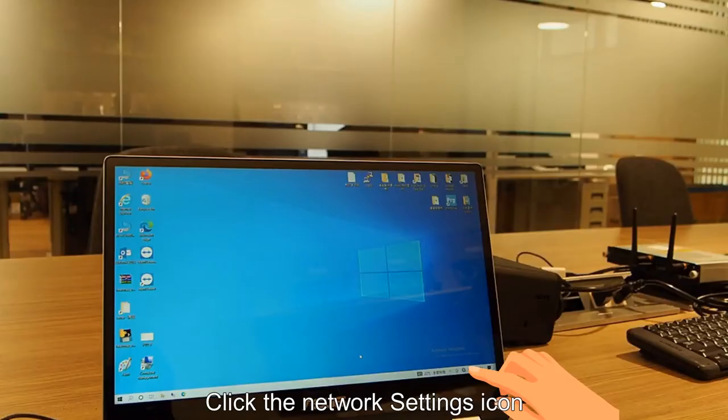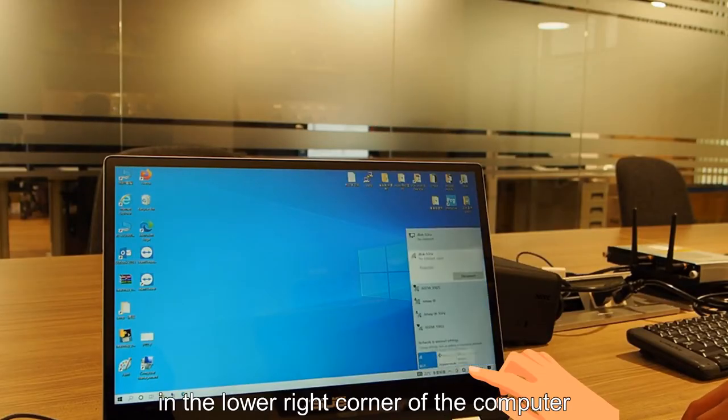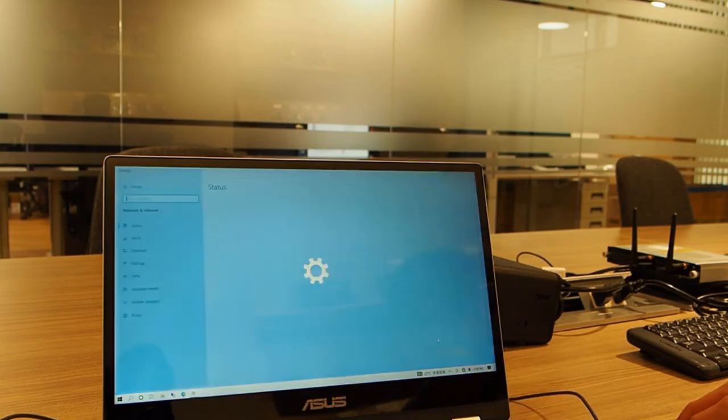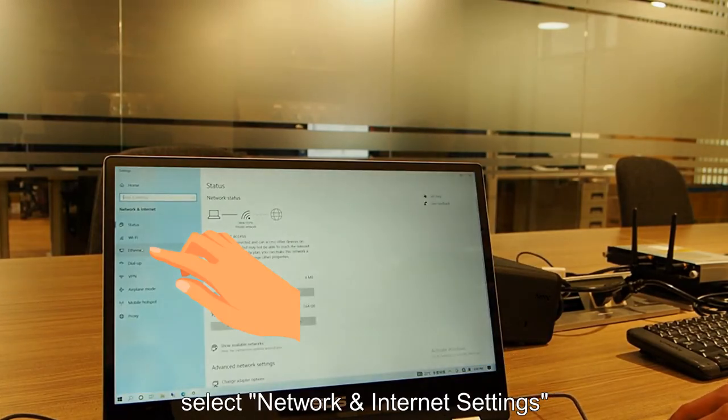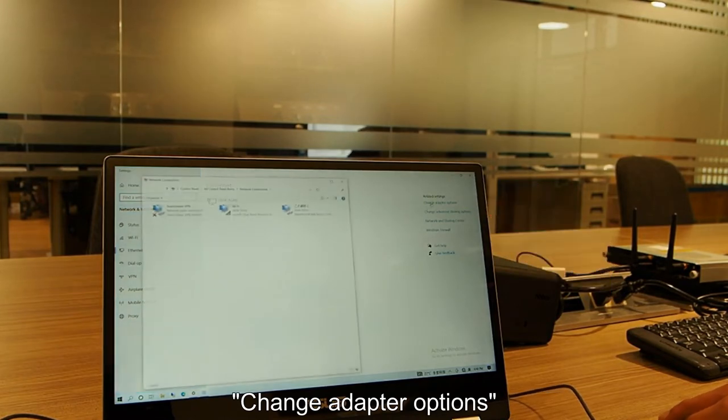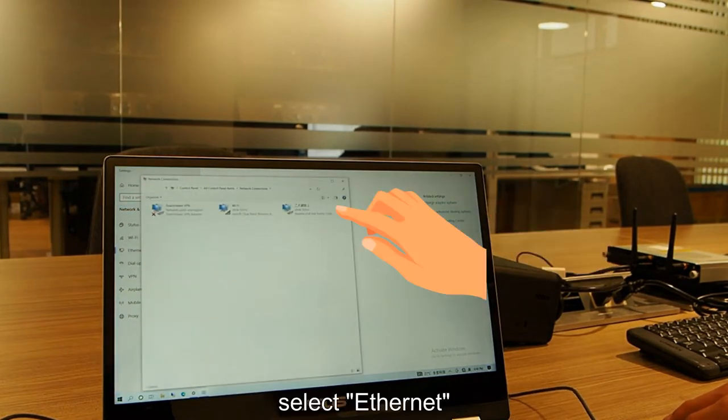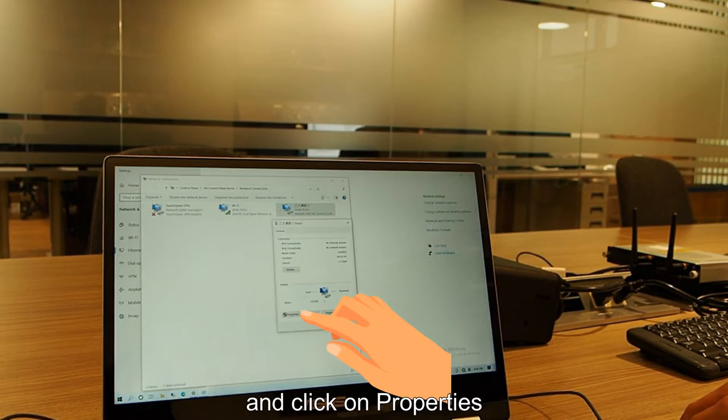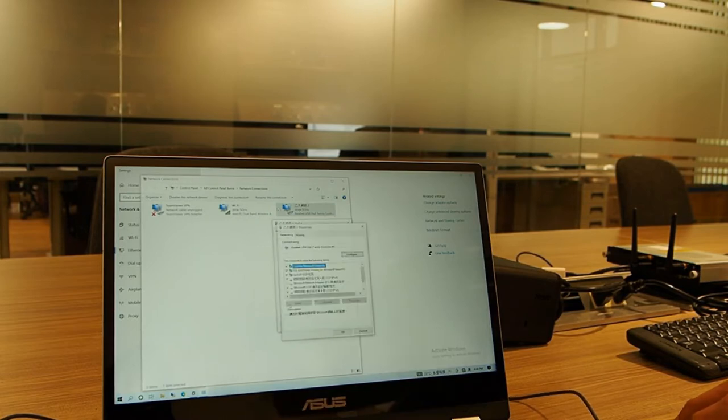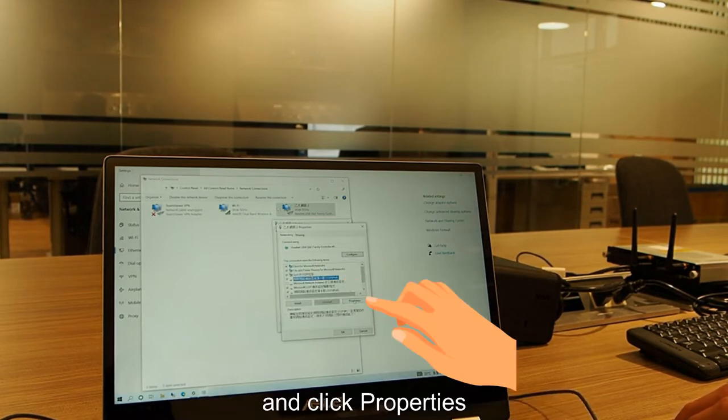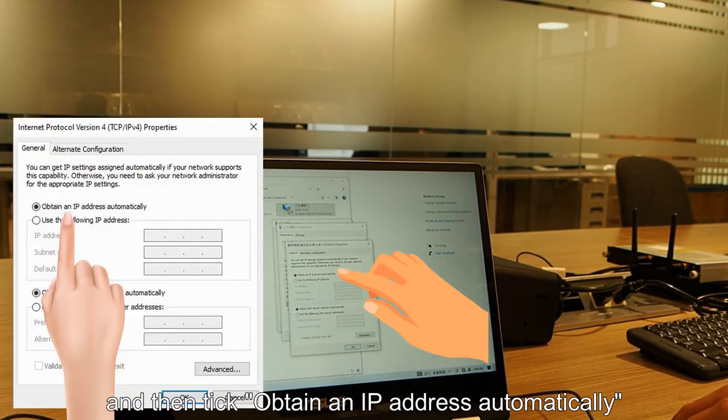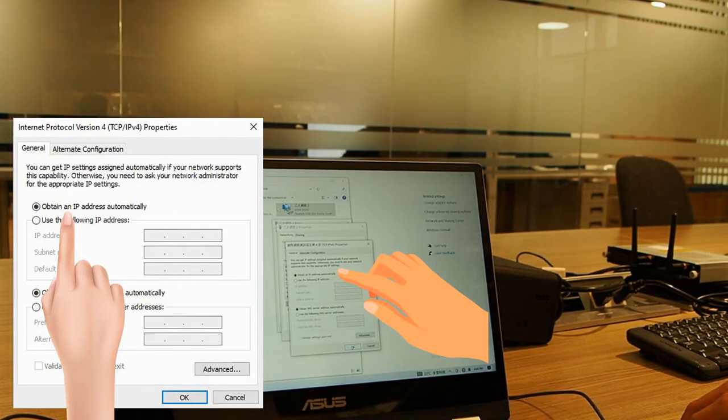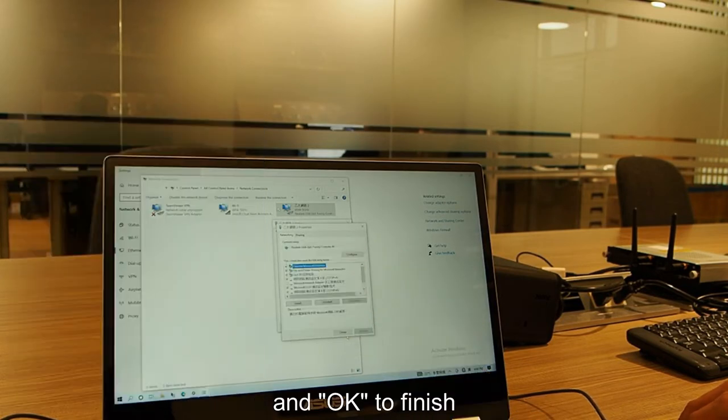Click the network settings icon in the lower right corner of the computer. Select network and internet settings, then change adapter options. Select internet and click on properties, then click on properties again. Click obtain an IP address automatically and OK to finish.